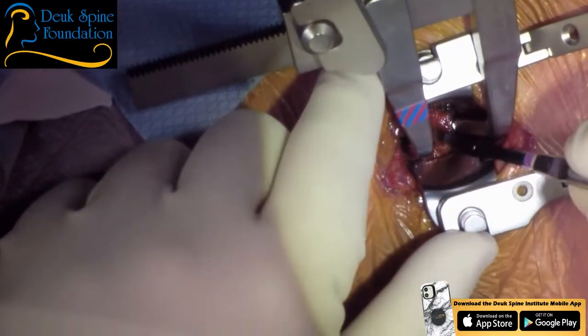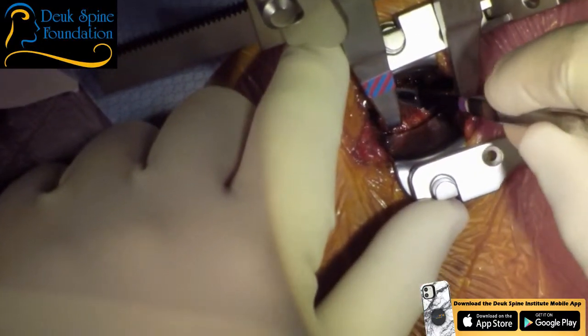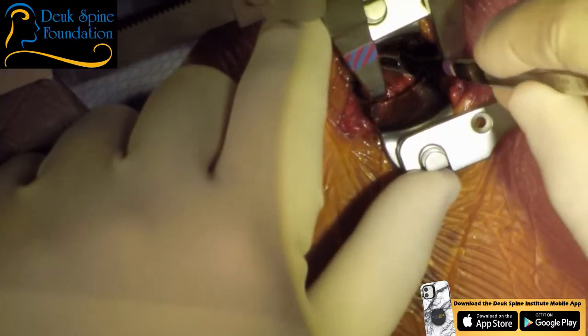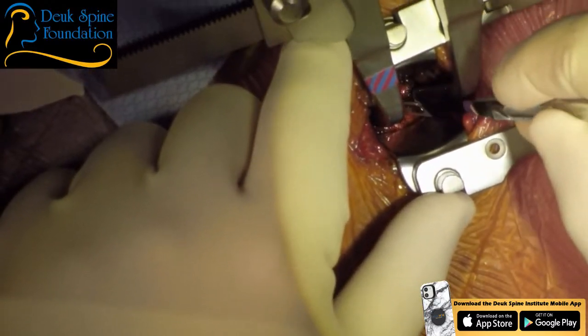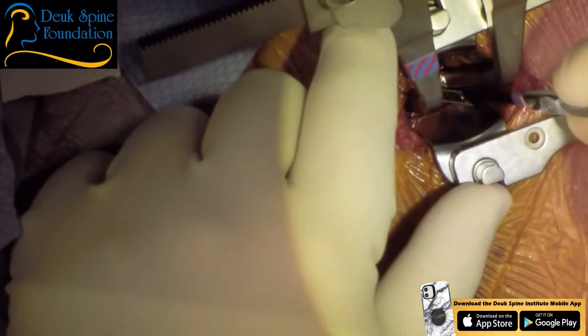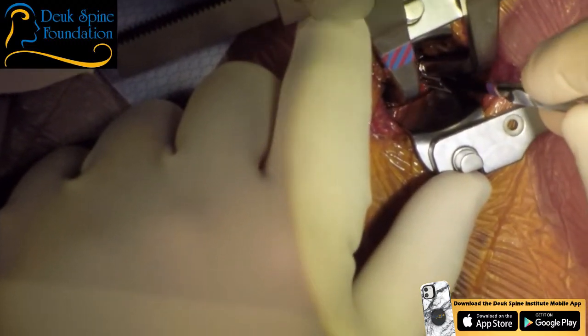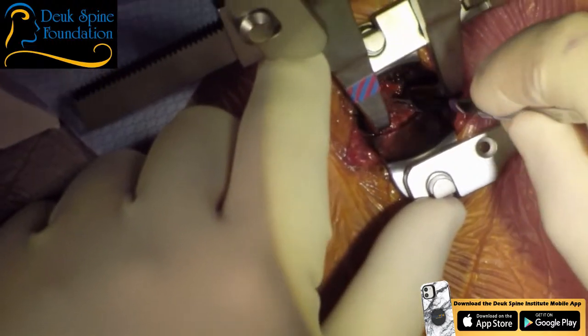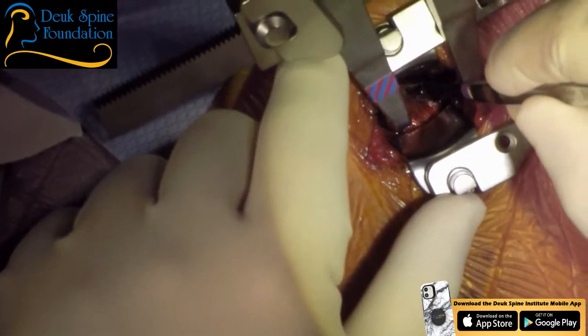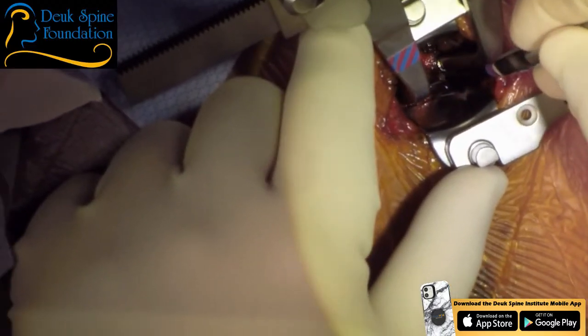Okay, right now we've got our distraction posts in, the disc is under distraction, I'm gonna cut through the annulus. Now look, the annulus is already disrupted, so this is evidence of trauma. Okay, this is a traumatic avulsion of the disc off the bone. And look, it's still attached down here at the bottom at C7, but it's avulsed, ripped right off the bone at the bottom of C6. So this is trauma, massive trauma.